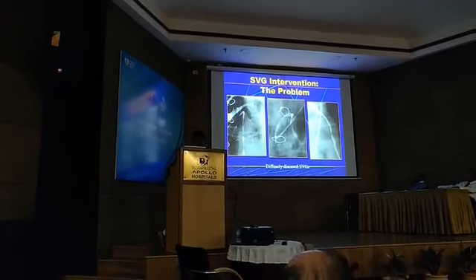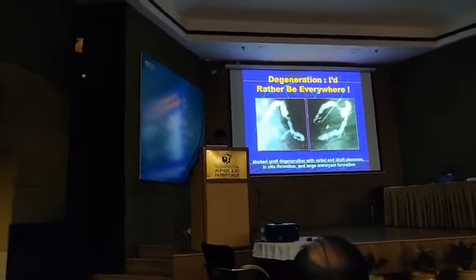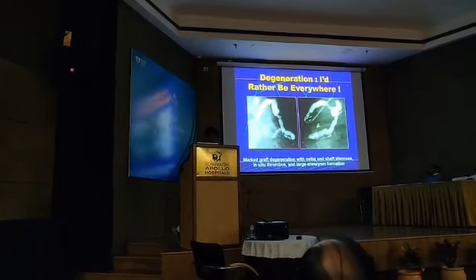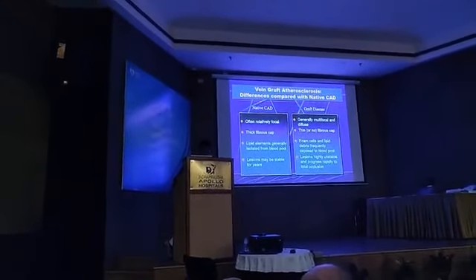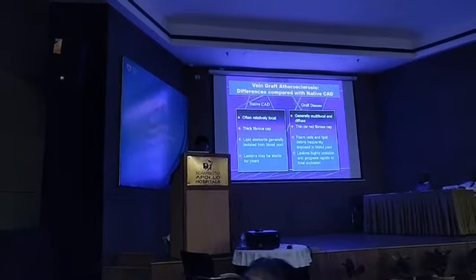With the saphenous vein graft, the problem is everywhere. You can see this is how a degenerative graft looks, with very bad atherosclerotic or non-atherosclerotic graft changes and graft failure. Degeneration is the common problem with the saphenous vein graft. And as we know, total arterial bypass is being done in only a very small percentage of cases.